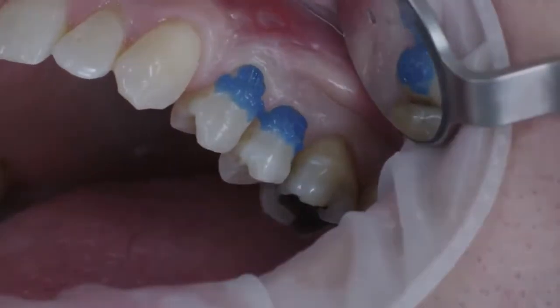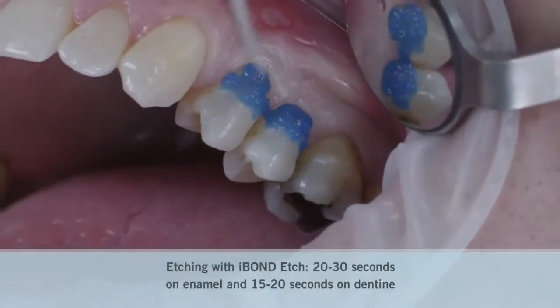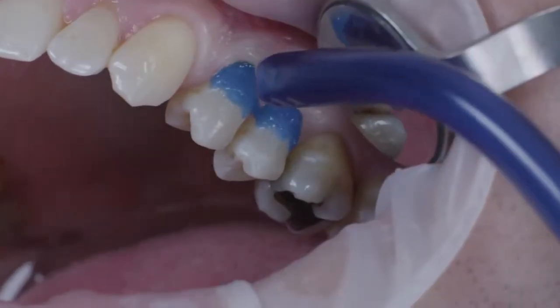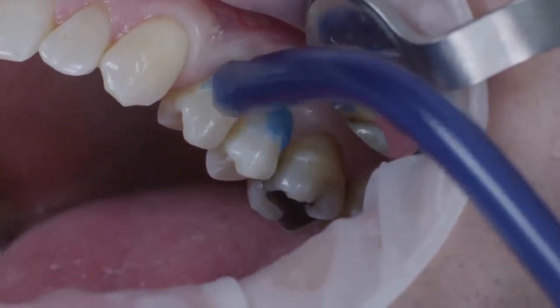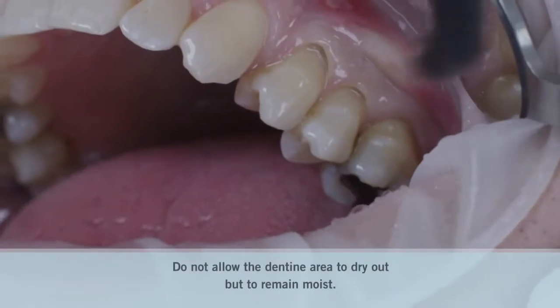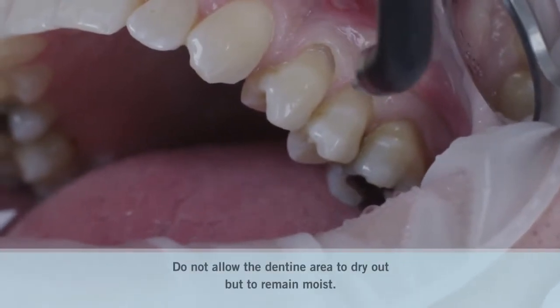I-bond etch was then applied to the tooth surface, beginning on the enamel and continuing towards the dentine. After the corresponding application time, the tooth was rinsed off thoroughly and then dried so that some residual moisture was retained on the surface.